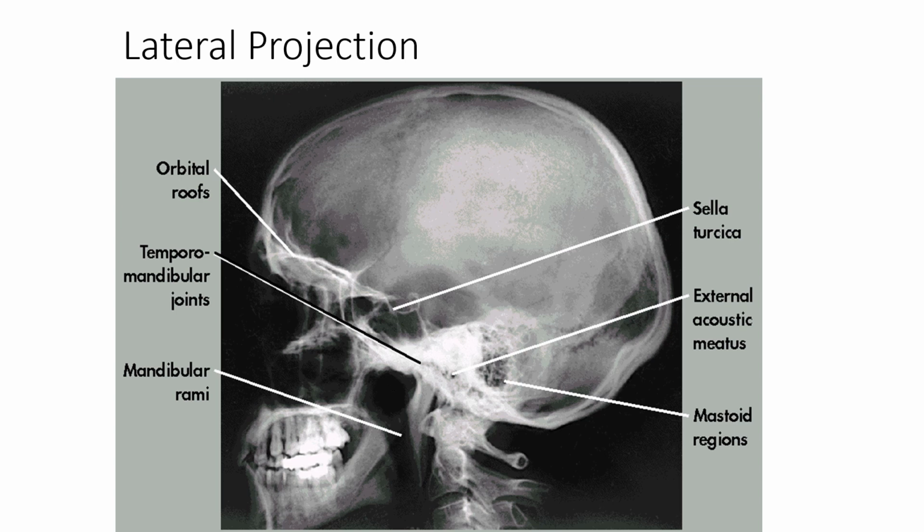Yeah, go anterior to that, and you can see the bone of the forehead, the frontal bone, coming up to, if you look, follow that around to the vertex of the head, and you see like a wiggly black line coming down. That's actually the coronal suture that you can see on this radiograph. So you should see the junction between the frontal bones and the parietal bones, and then the parietal bones sweep toward the back, and you may see another wiggly black line right below where it says sella turcica. That's the lambda and the lambdoidal suture.